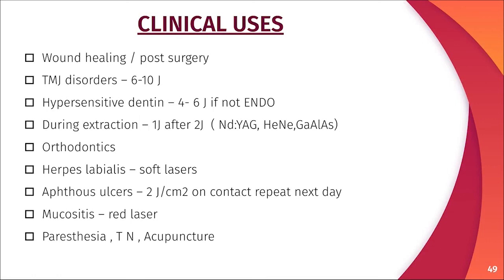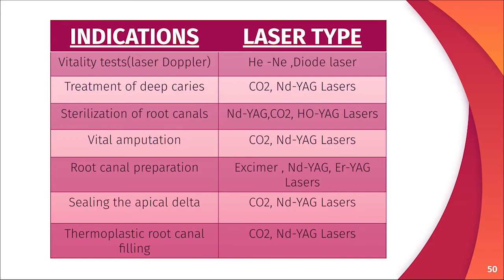Other clinical uses of lasers other than the restorative dentistry and the endodontics, we can use lasers in wound healing or post-surgery, TMJ disorders, hypersensitive dentin during extraction, orthodontics, herpes labialis, aphthous ulcer, mucositis, paresthesia, trigeminal neuralgia, acupuncture.